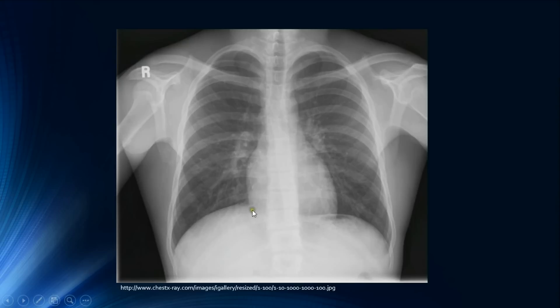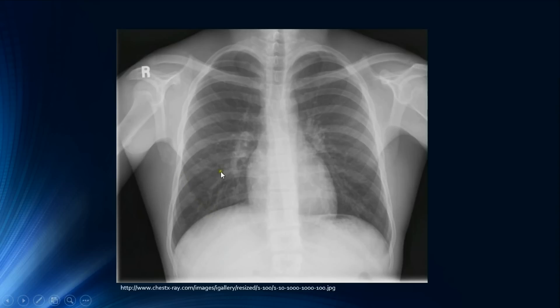To check for inspiration, the sixth rib should intersect the mid-clavicular line at the diaphragm. Counting the anterior ribs: one, two, three, four, five, six — the sixth rib is exactly intersecting the diaphragm at the mid-clavicular line, so this is adequate inspiration. For penetration, we can easily see the vertebral spine behind the heart, confirming this film is adequately penetrated.